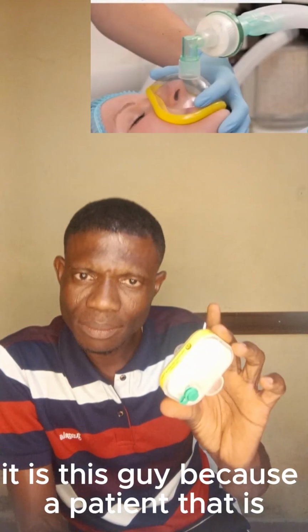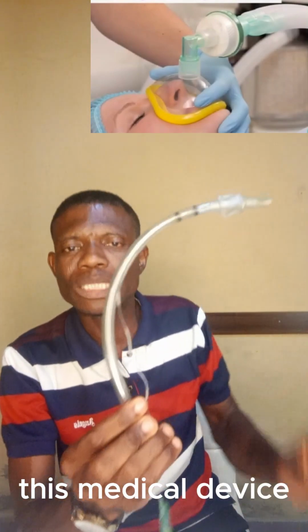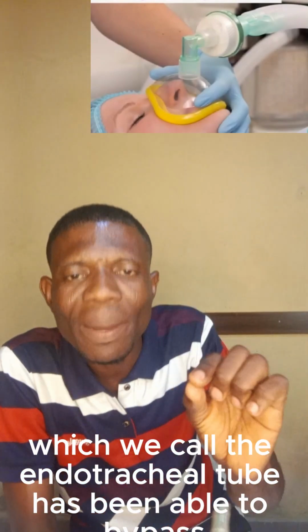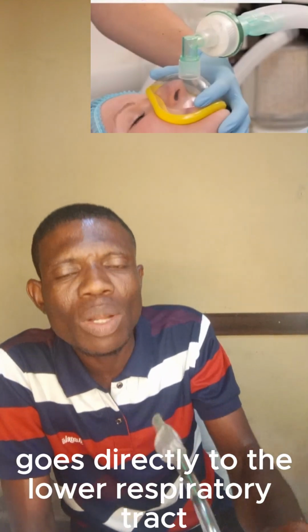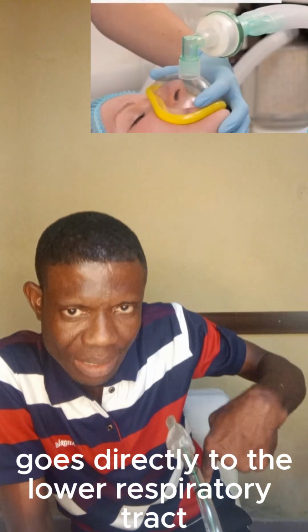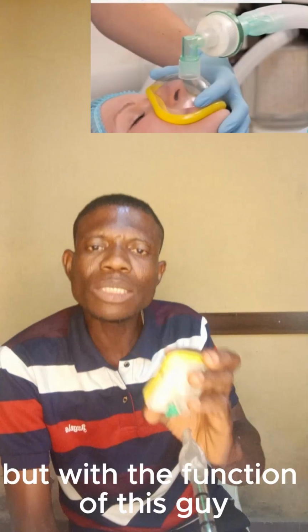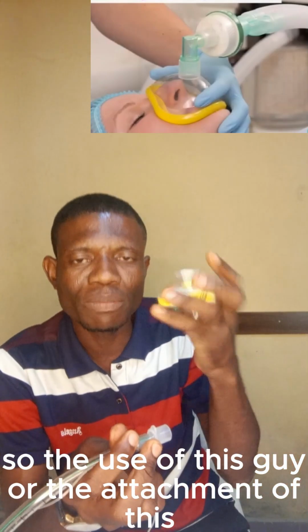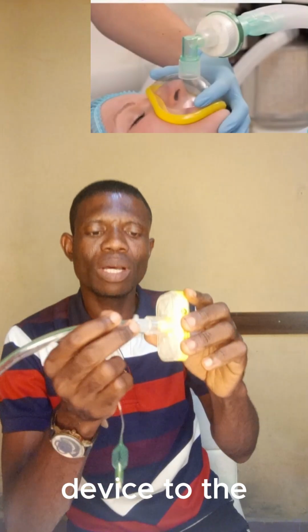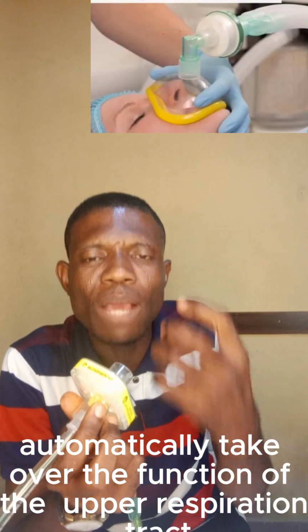It is this device. A patient under general anesthesia has an endotracheal tube, which has bypassed the function of the upper respiratory system because it goes directly to the lower respiratory tract during general anesthesia. But with the attachment of this device to the endotracheal tube, it automatically takes over the function of the upper respiratory tract.